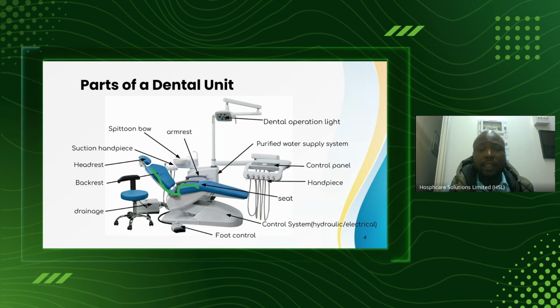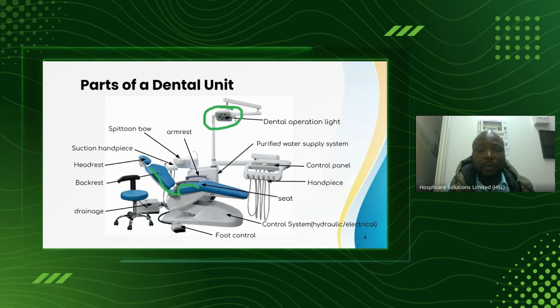In addition to that, we have a dental light here. It enables the doctor, the surgeon or the dentist to visualize the area of the procedure. We have several types of light: this LED one, we have halogen ones, and more.